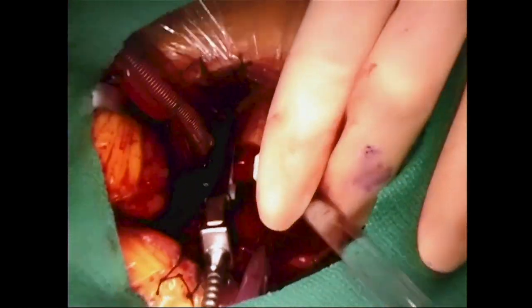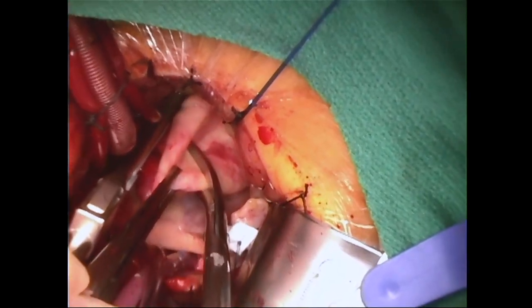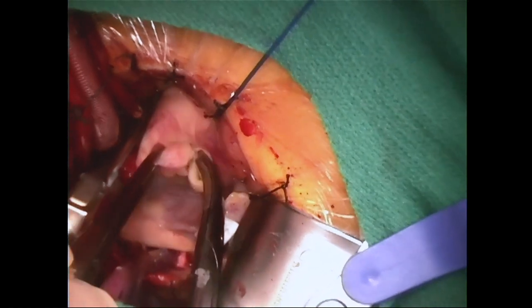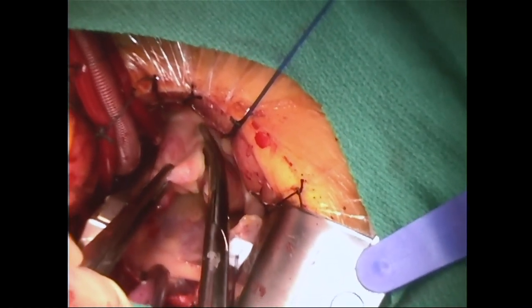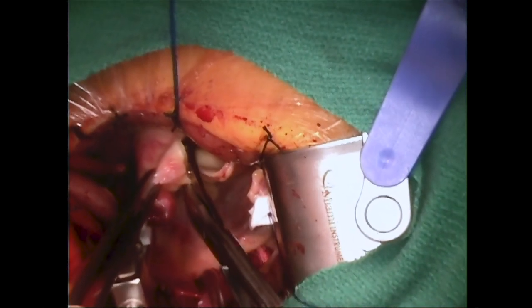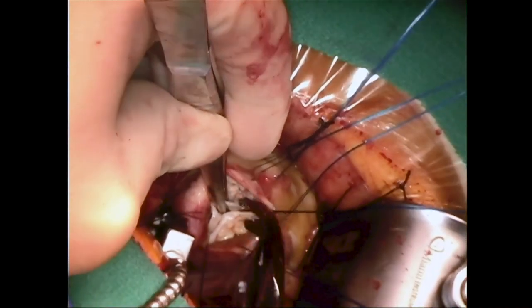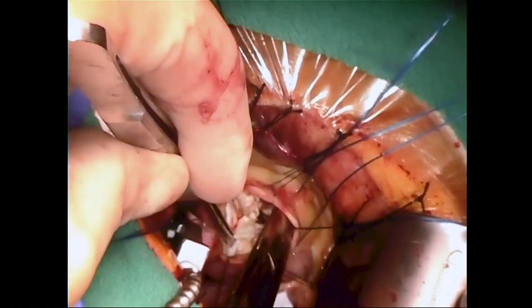The aortic cross clamp is applied; we use a Cygnet aortic clamp. Cardioplegia is given directly, and we prefer to use Del Nido cardioplegia. If there is significant aortic incompetence, one may give retrograde cardioplegia directly through a cannula placed from the right atrium or placed previously by the anesthesiologist through the neck.